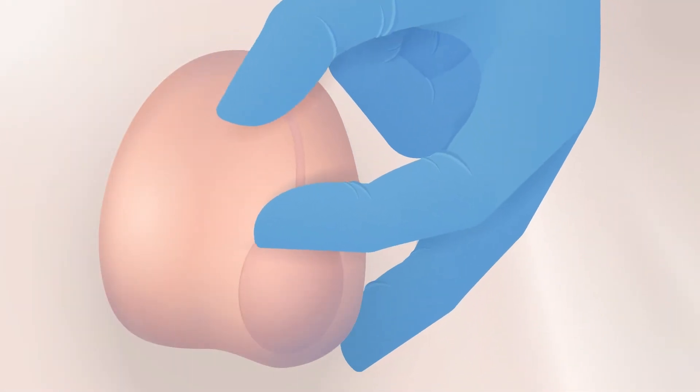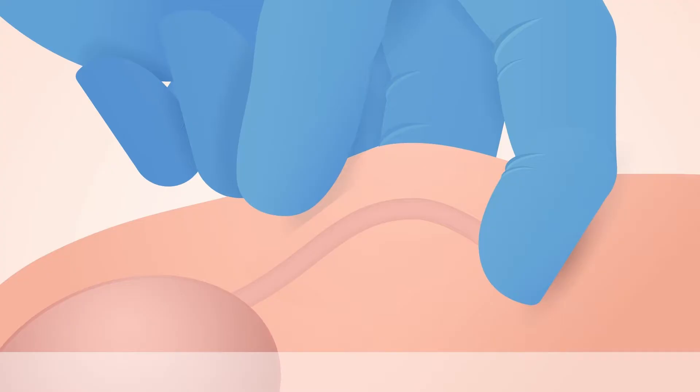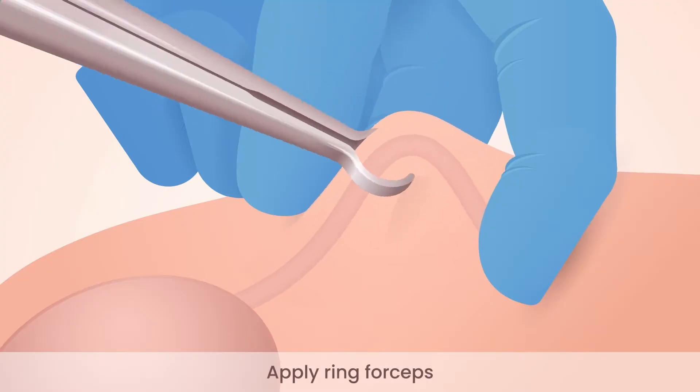Starting on the left side, isolate the tube with a three-finger technique. Apply ring forceps to the tube and skin and level to the horizontal.